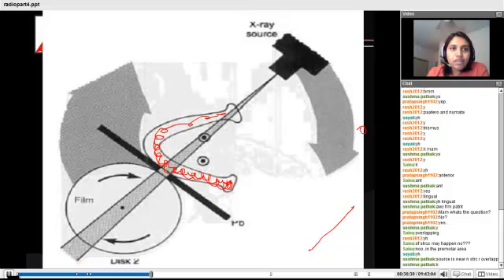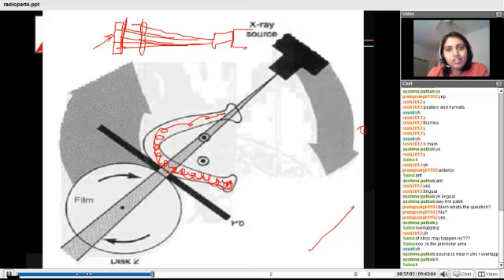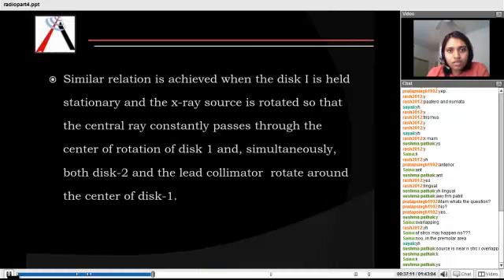So normally when we take a radiograph, how it happens is the radiograph passes through the object and it puts an image on the film. Here what happens, normally our film is stationary, our X-ray source is also stationary, right? But here our X-ray source and film are moving. But when we say moving, let me go to the principle of this first.